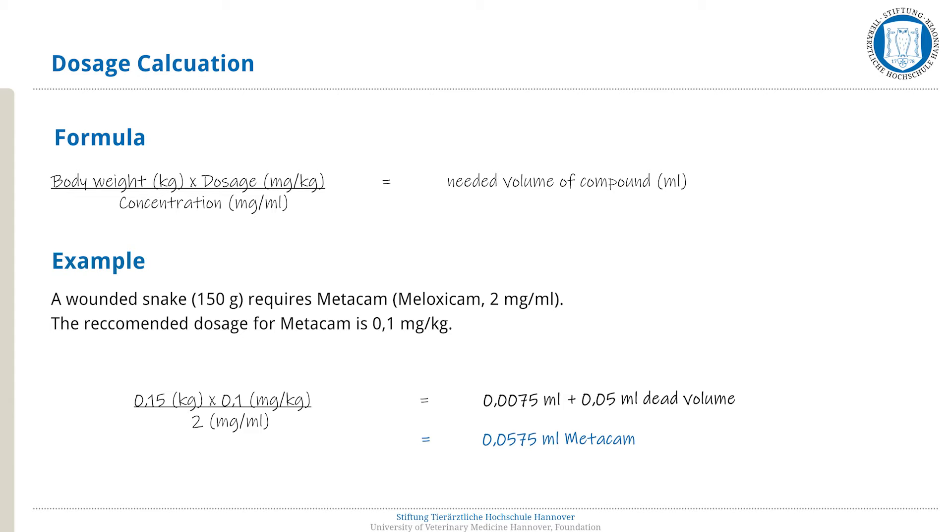Note: a maximum of only 1 milliliter can be injected into the snake simulator subcutaneously.